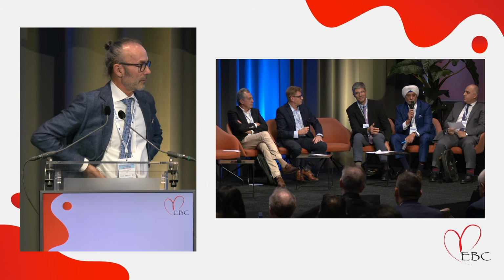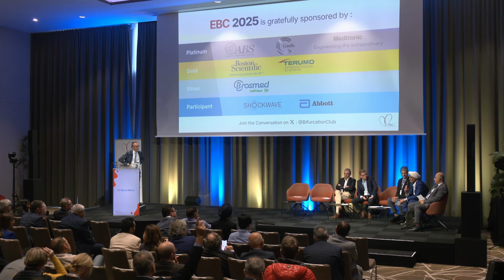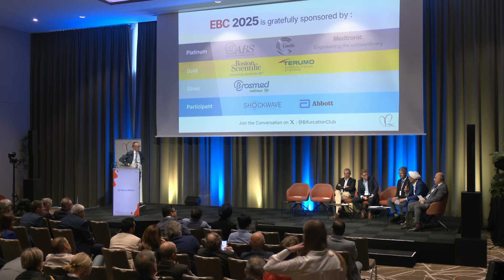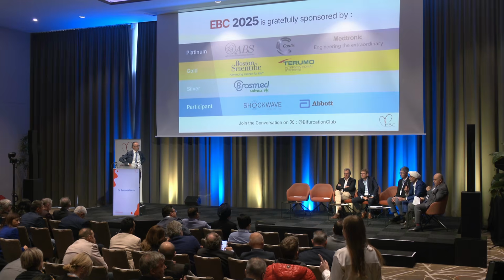Another comment on balloon inflation and a dent, where you pull back and you see the dent. Unfortunately, all the studies did not really do imaging, and you tend to miss the ostium a lot, and that goes against everything you do. So I think you have to be careful, and if you do that, you want to make sure that you've covered the ostium on imaging, because even if you inflate, you see the dent. As soon as you inflate the stent, it usually moves, and you'll miss the ostium. So you have to be very careful. But as I said, imaging in those scenarios is always mandatory.